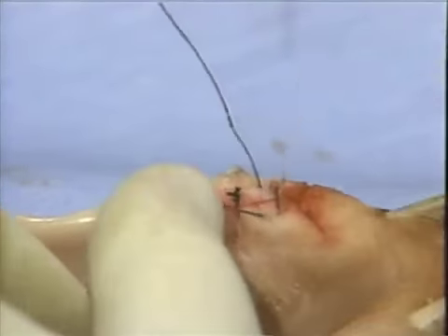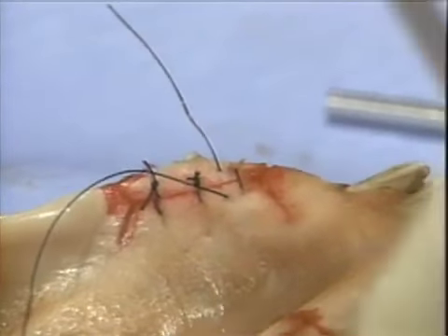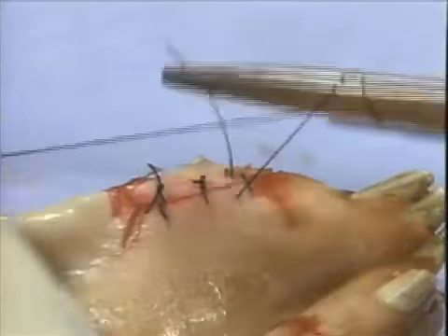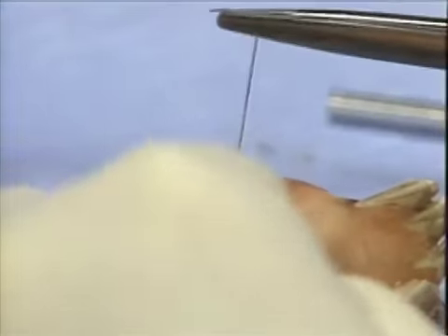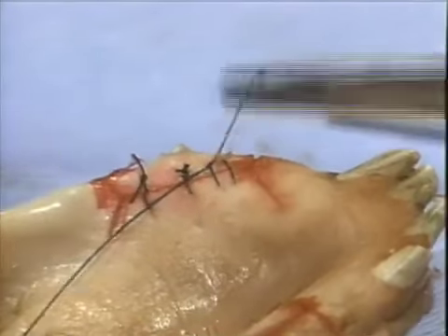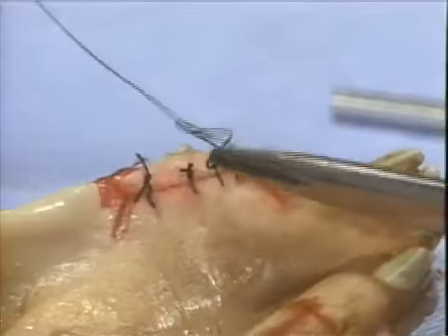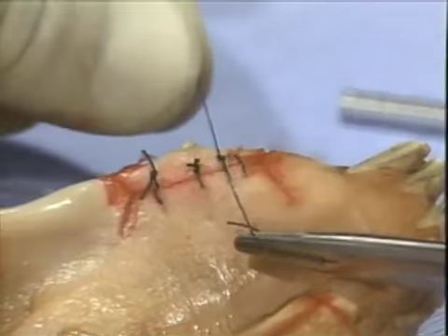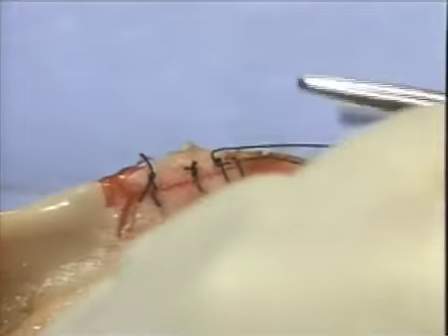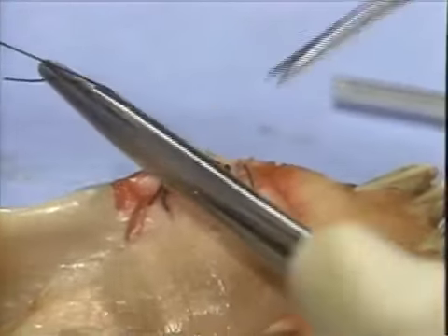Again, the external mattress suture has definite advantages in certain clinical situations, including closure of distal wedges, closure of flaps over bone grafting material, and in other special applications. The suture is tied with a typical surgeon's knot, again using the typical sequence of two clockwise turns, followed by a counterclockwise turn, followed again by a clockwise turn, and is cut leaving a 3 millimeter suture tail.